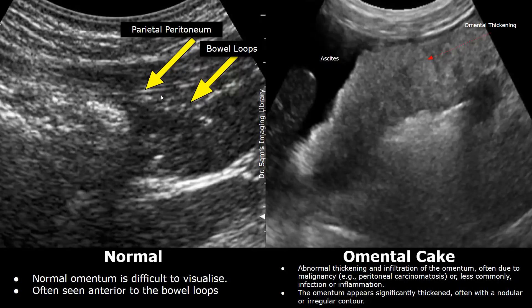The omentum is more easily seen in case of a pathology when it is thickened. This image shows a thickened omentum. You can see a thick irregular structure. This is called an omental cake because it has a cake-like appearance. Omental cake is usually seen in cases of advanced disease, such as malignancies.